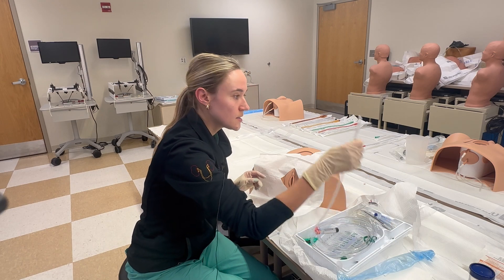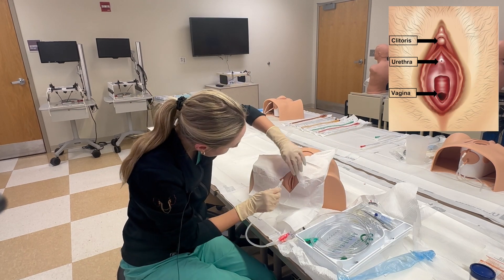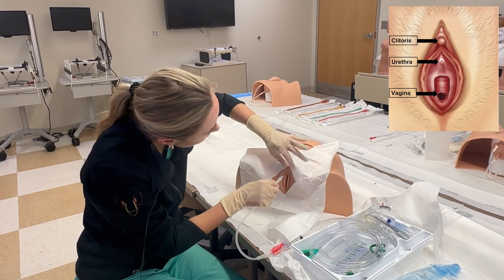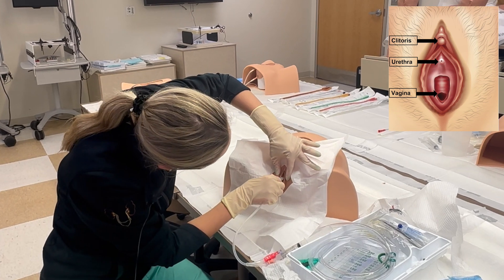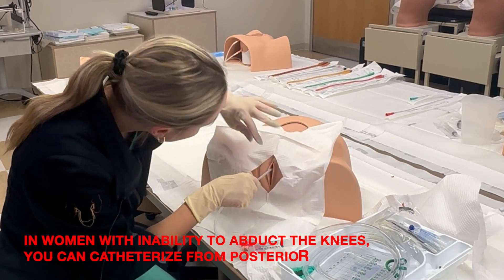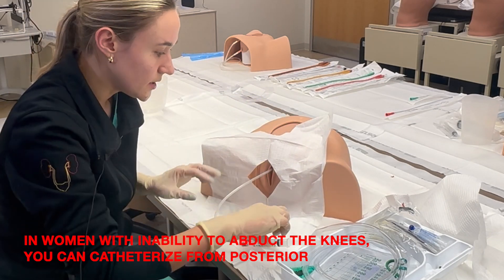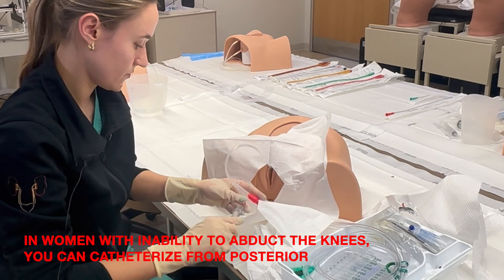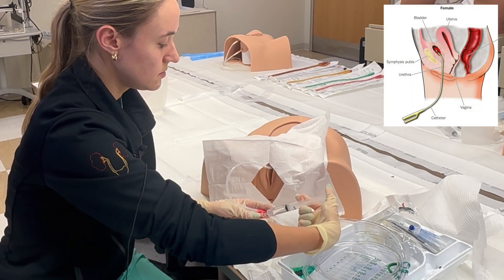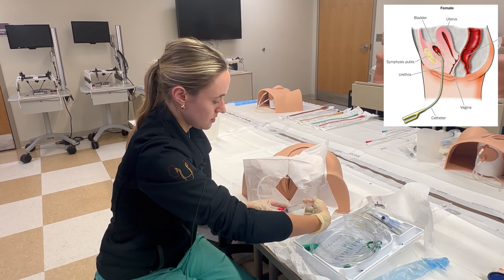Let's say we don't need to do those things. Take the tip of the catheter — sometimes having a colleague help you spread the labia is very helpful; the greater the teamwork, the better. You really only need to place it a couple centimeters within, wait until you see urine return, and then go ahead and inflate the balloon.